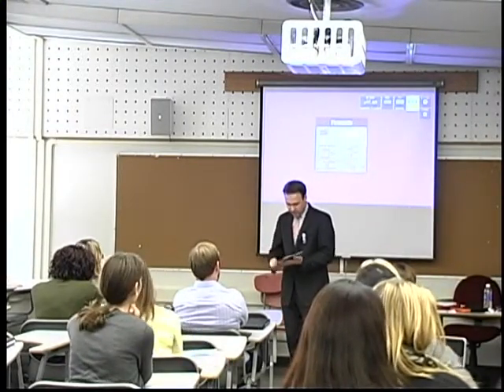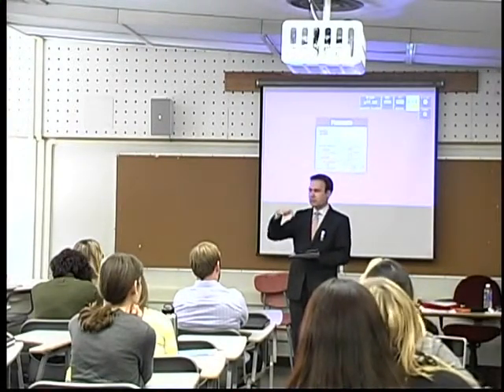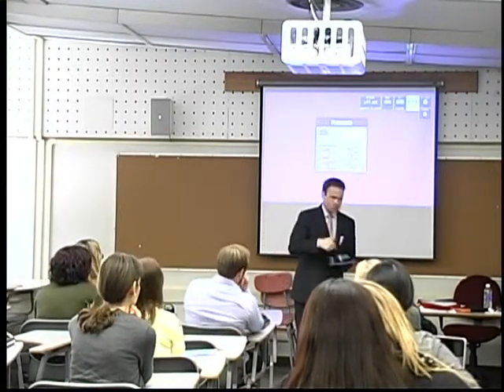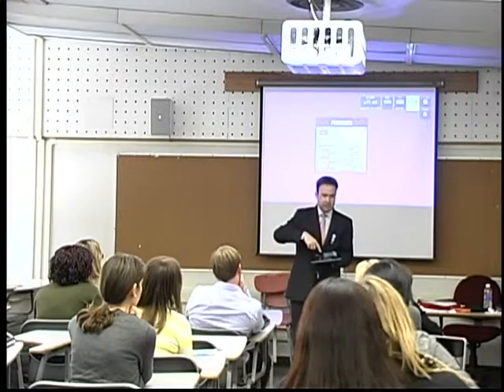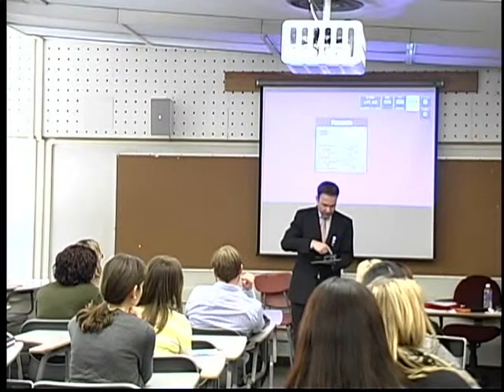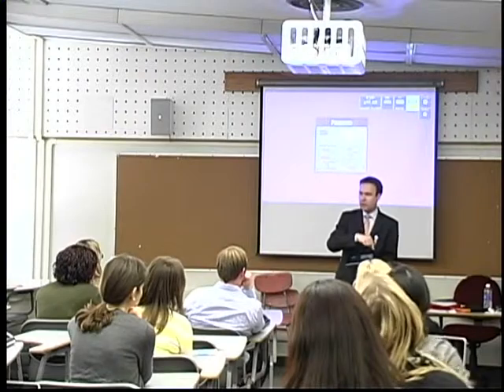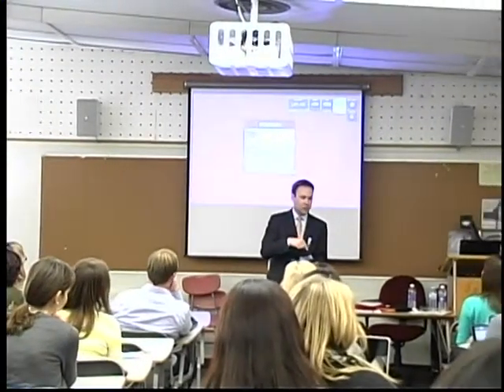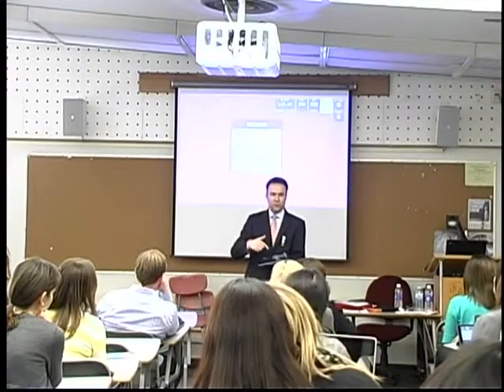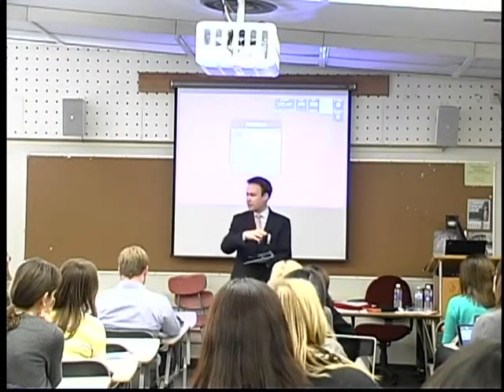Under learner settings, we can switch from one touch, which is automatic activation as soon as I'm touching the symbol, to drag and drop, which means dragging and dropping symbols onto that sentence strip. Order activity means the way the activity sheets on the top are displayed can be organized, so you are setting priorities. You want foods and toys to come first before colors, emotional needs and other stuff.